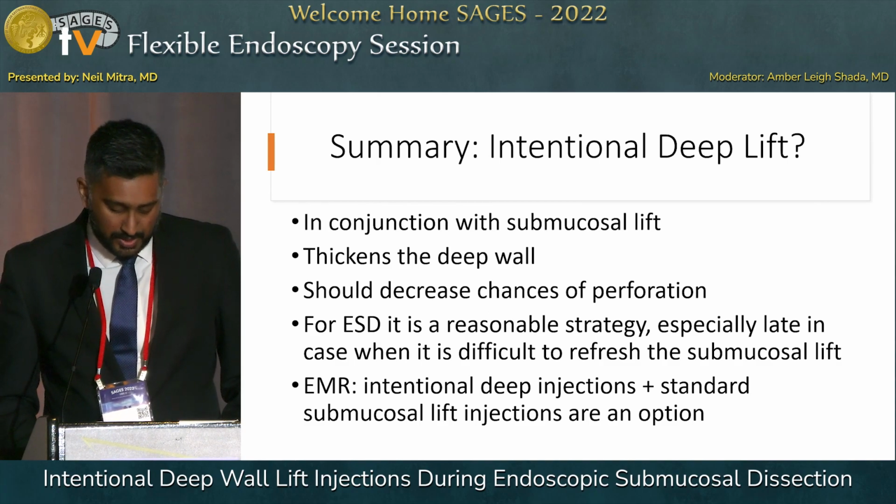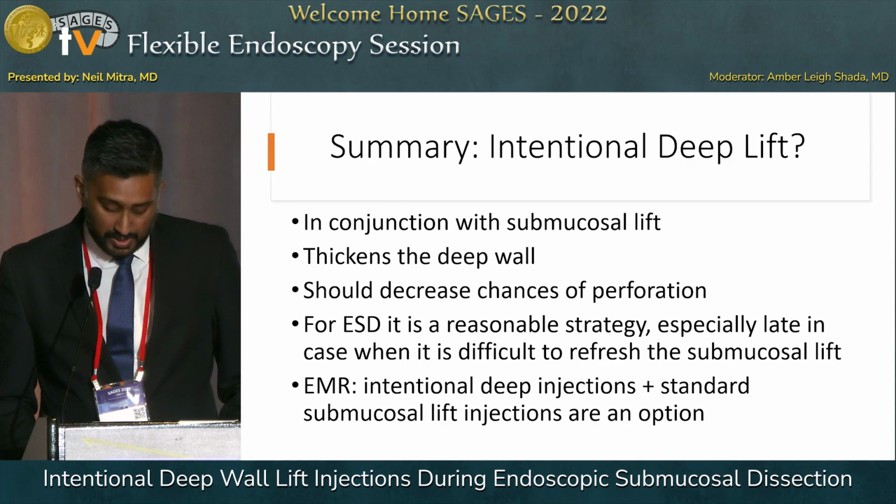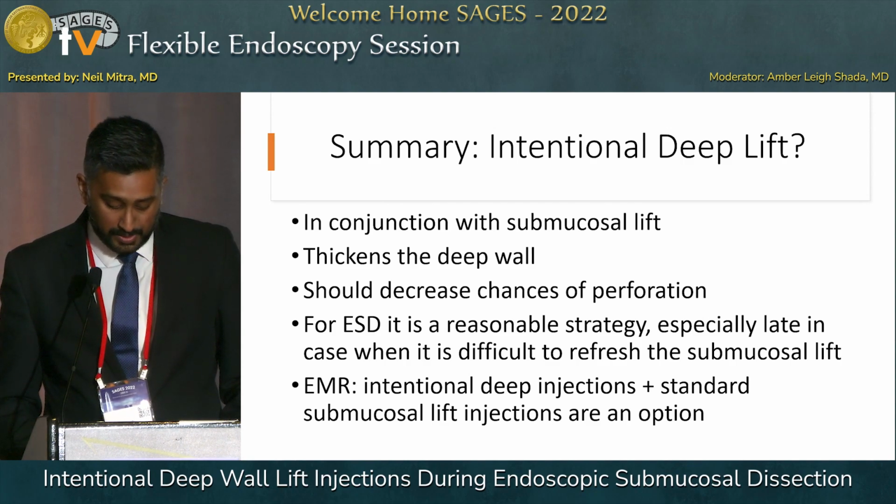Intentional deep wall expansion in conjunction with a submucosal lift should decrease the chance of perforation in ESD or piecemeal EMR. This makes sense, especially later in the case, and the authors now are using this approach clinically.